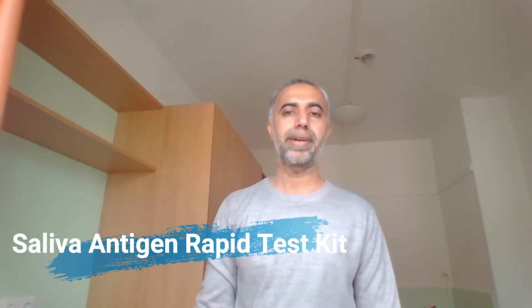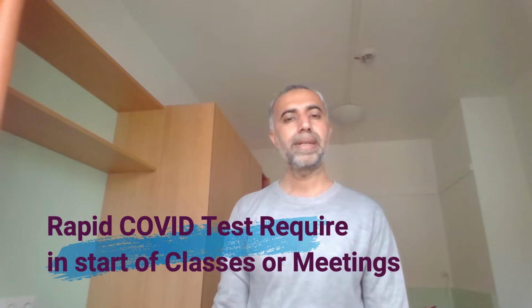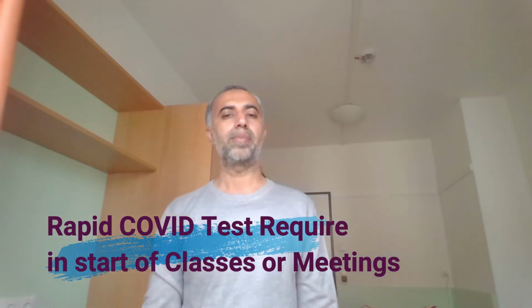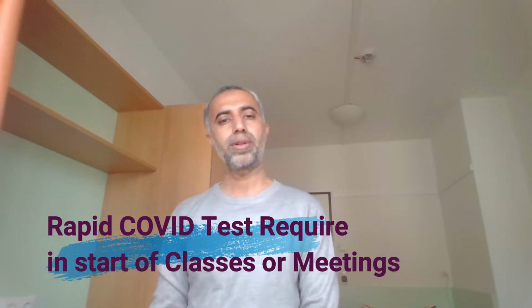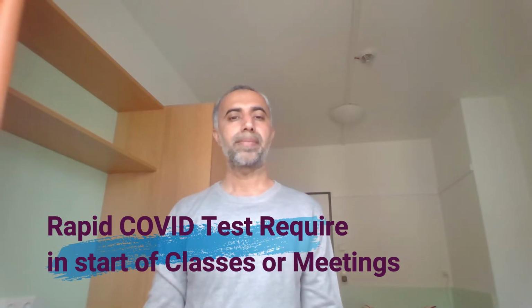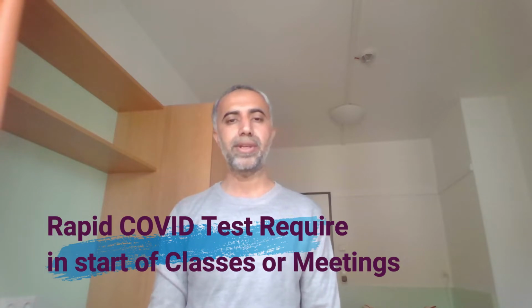Nowadays, COVID is getting long and long. Therefore, certain emergency meetings and university classes are going to be conducted. For this reason, particularly in the Europe region, it is very important to test the people or participants for COVID. Mostly they are using the saliva antigen rapid test kit.